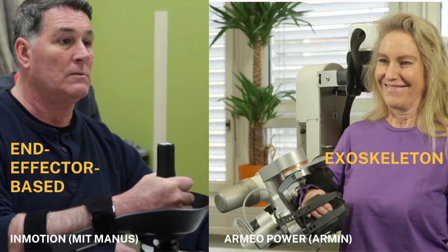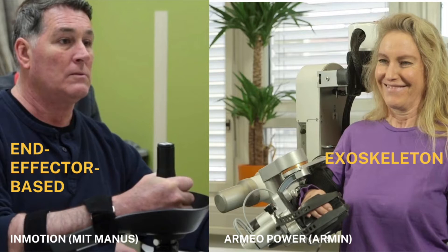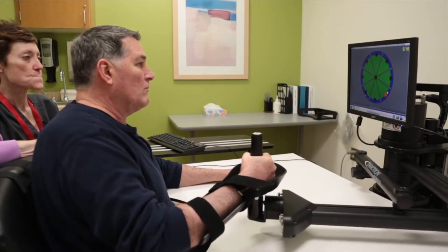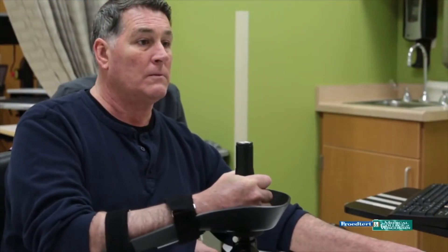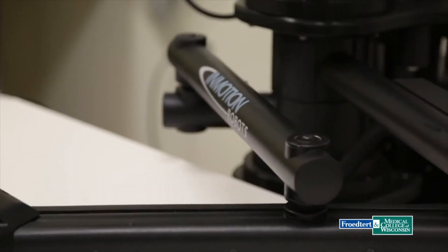From the design point of view, upper extremity rehabilitation robots can be classified into end-effector-based robots and exoskeleton-type robots. End-effector-based robots are simple, and the patient's hand is attached to the handle of the robot to follow a specified trajectory.